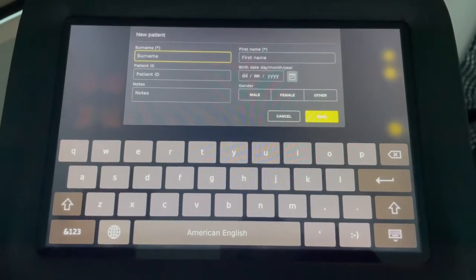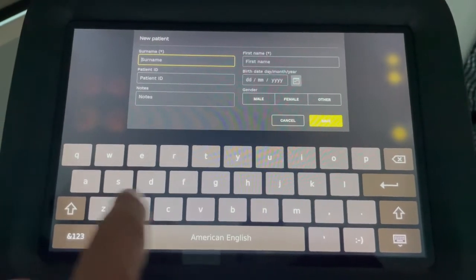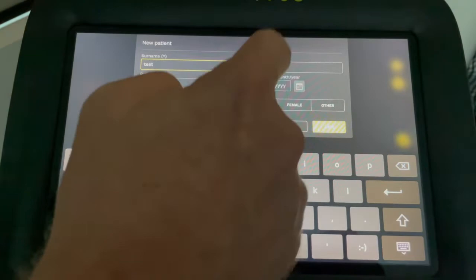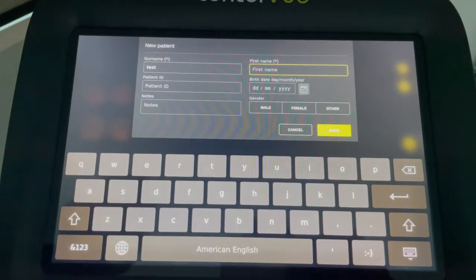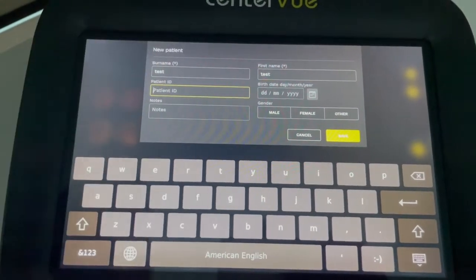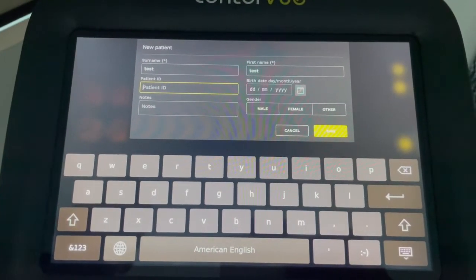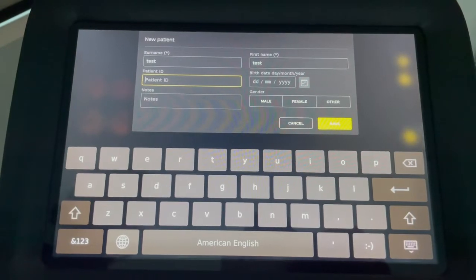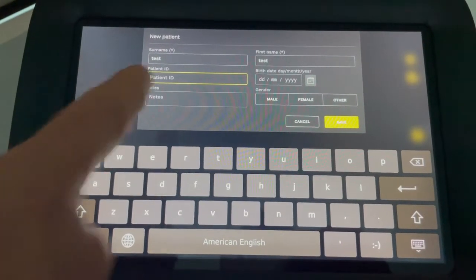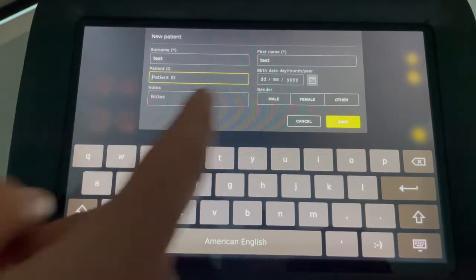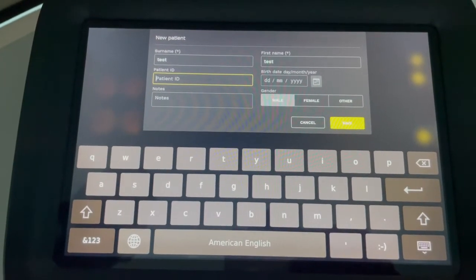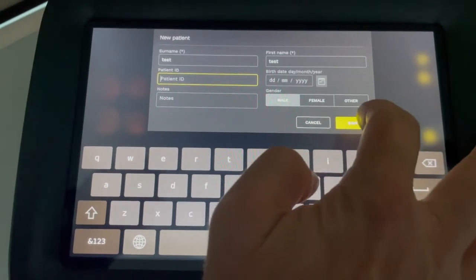First of all, it's asking for a surname. I'm just going to put 'test'. First name — just click in, highlights in yellow — I'll put 'test' again. There's a patient ID option here which, if you need to put a patient ID in, there's a facility there. They ask you for your date of birth, any notes that might be applicable, and ask for male or female. Once you've input that data, then you can press save.